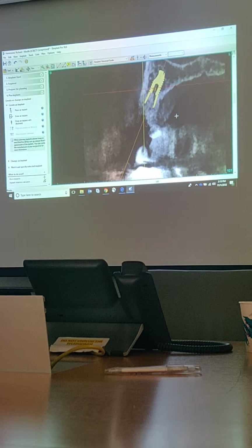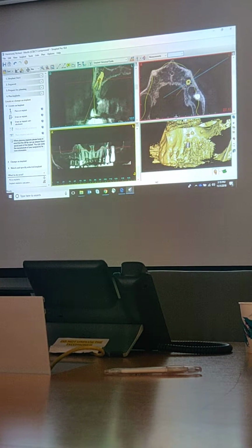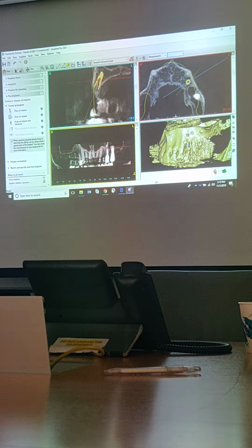I have a question. Would it be advantageous to tell DDI we want a maxillary scan, but we're going to be placing implants in these areas? If you tell DDI that every single patient is supposed to be opened a little bit, that will not make any difference for you for any type of case, because it's not going to make any difference when it comes to clinical planning, surgical planning, digital planning, or seeing what we need to see within the scan.